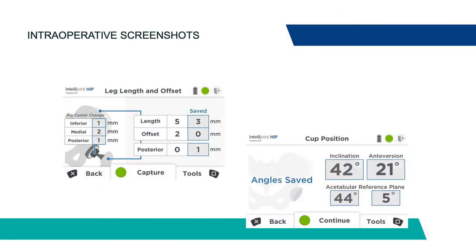Attached is an intraoperative screenshot so you can see what we're looking at intraoperatively. We were able to get changes in hip center along with leg lengths and offset. In the bottom right, we're also able to get a screenshot of component position afterwards, and we could map this preoperatively and postoperatively to see the reference planes and changes in component position. These revisions consisted of simple acetabular component exchanges all the way to pelvic discontinuities and large defect cases, so there is a large variation in acetabular defects.